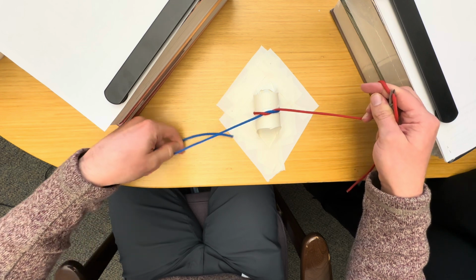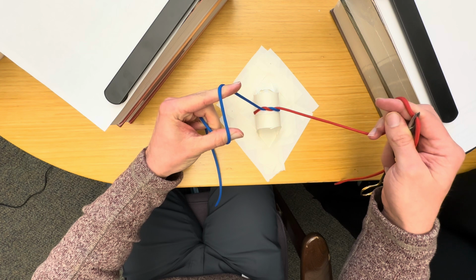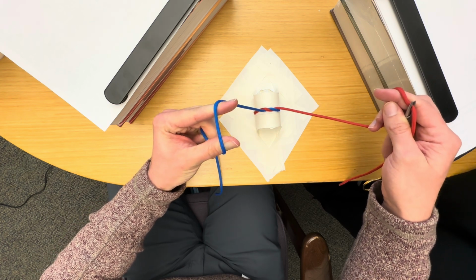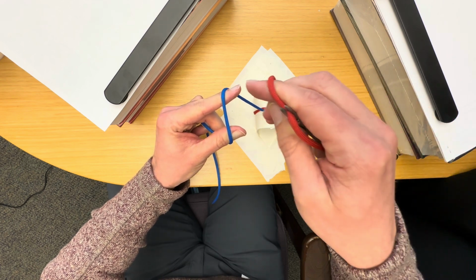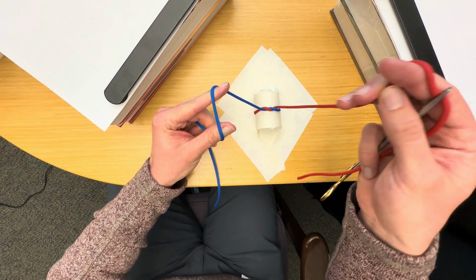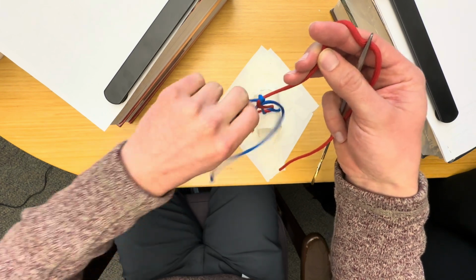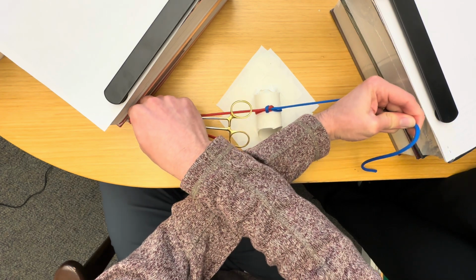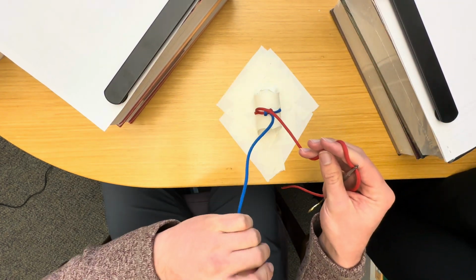The other move is what you might hear called the C. So you have the string in between your thumb and forefinger, and you bring the string with the needle and needle driver in the middle. You have your index finger come through, grab the tail, then you rotate a little bit, and it should look like that. Now we just did our C, so we do our karate chop again.